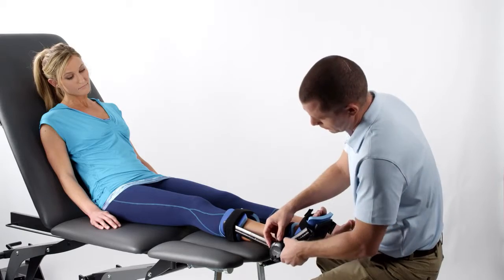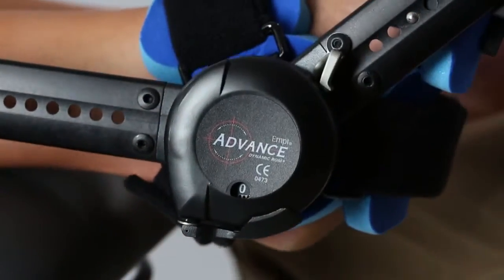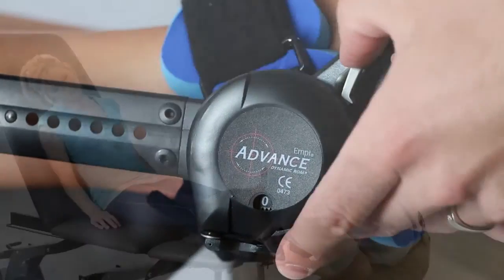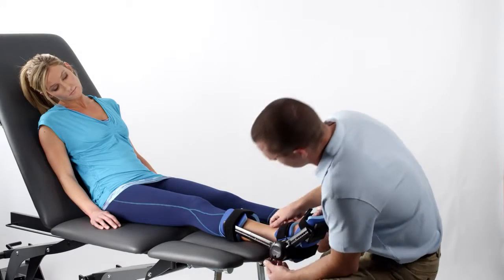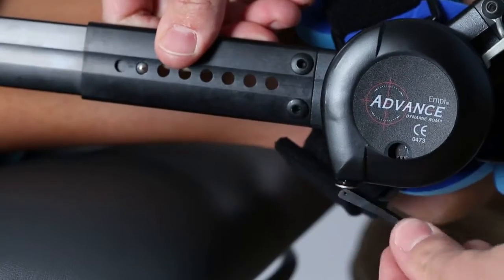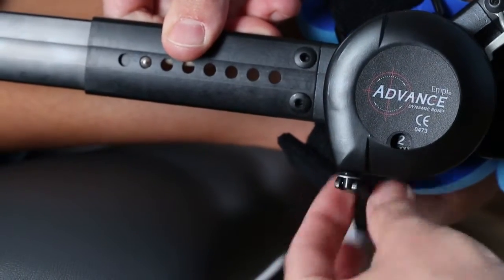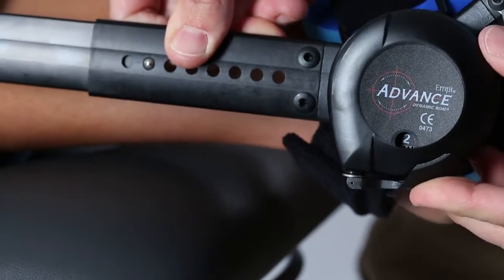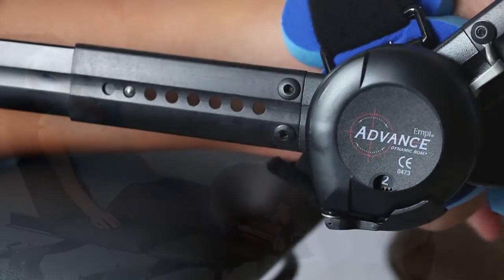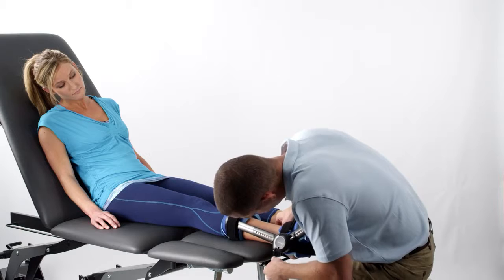When you adjust the tension, make sure that the lock lever and safety are in the locked position. Then check the tension indicator window to verify that it's set at the correct current tension level. The numbers that appear in the indicator window start at 0 and increase to 10, with each number representing an increased level of torque.